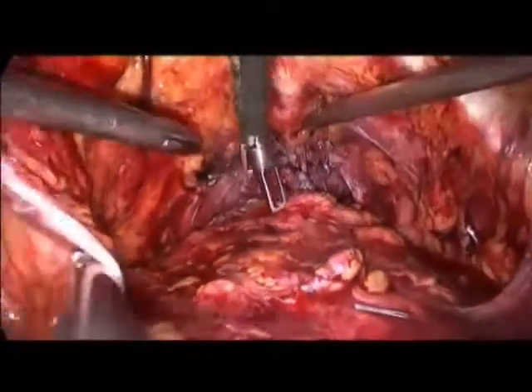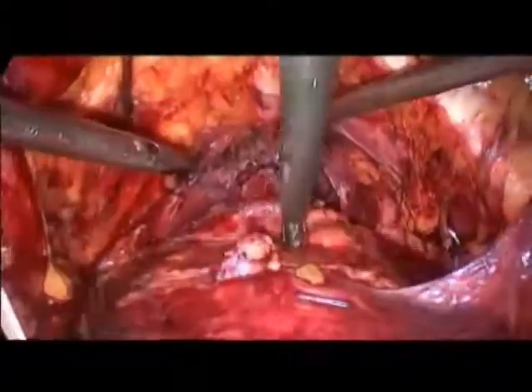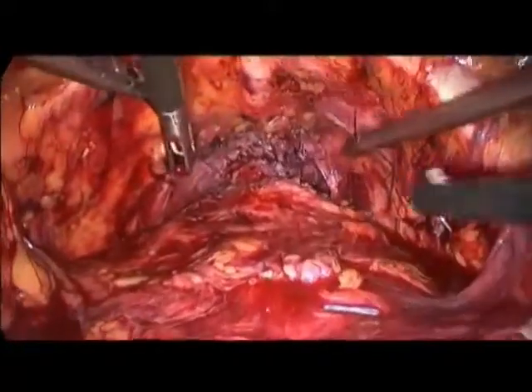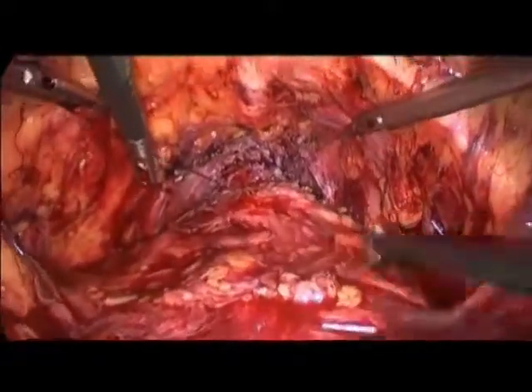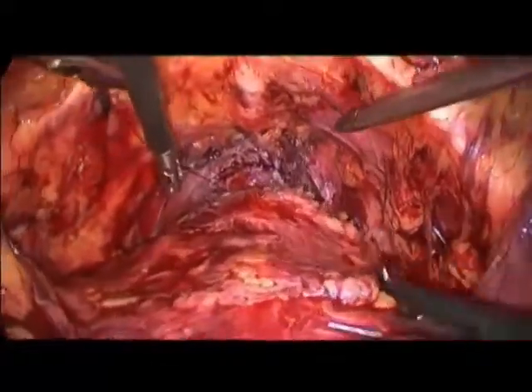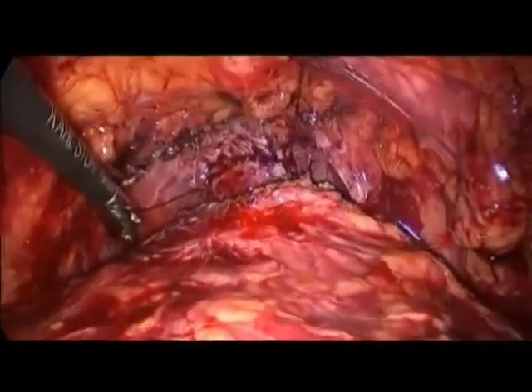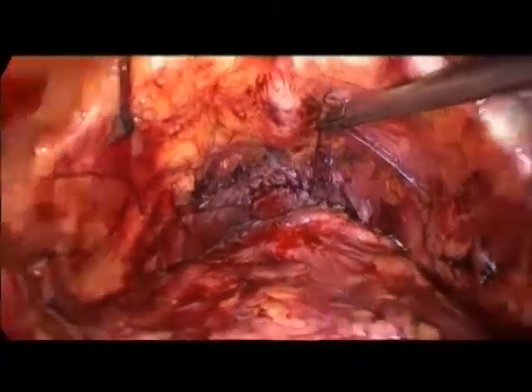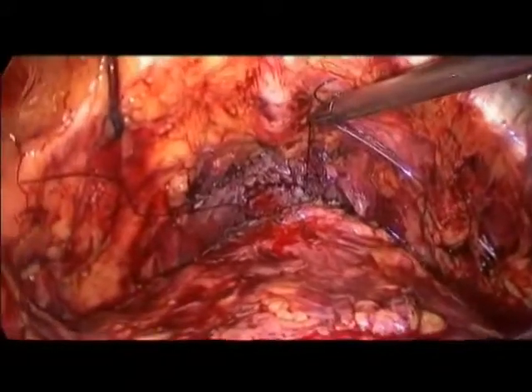Okay. But now you have to continue with. Are you doing now another continuous suture, or are you? We just complete the anterior aspect, and we will stabilize both former threads with this new suture. So you can use one suture and suture it to the threads. Finally. Exactly.